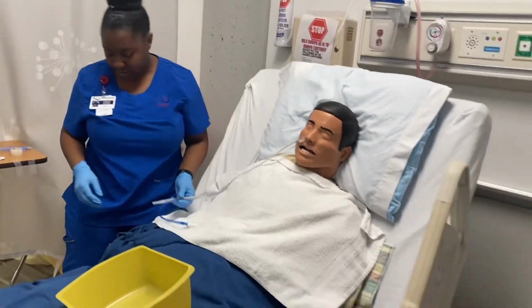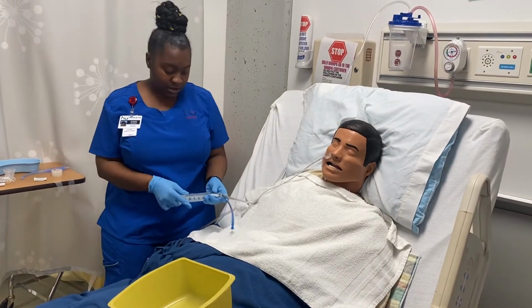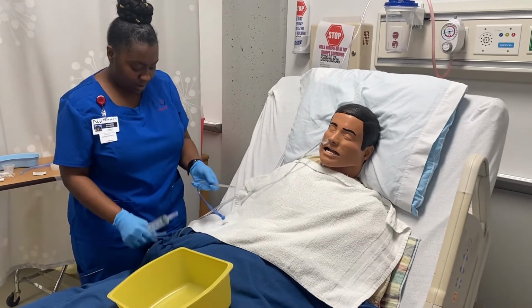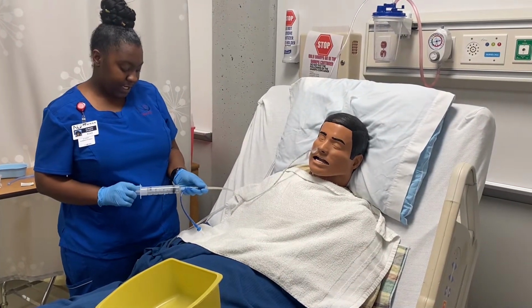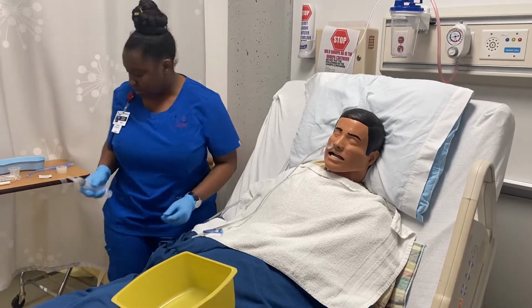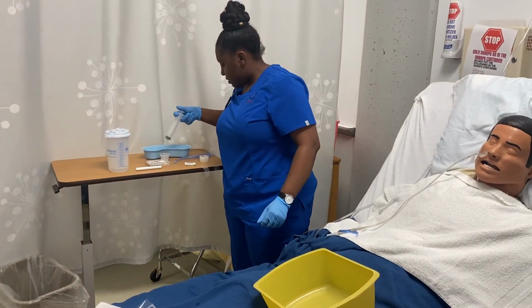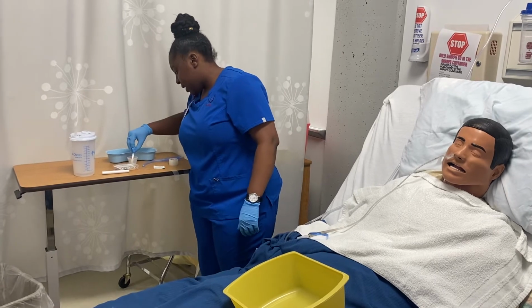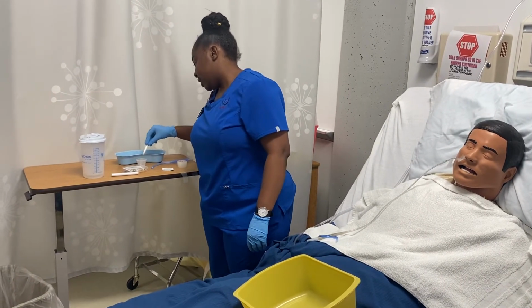And I'm going to take a piece of tape just to hold it there for the moment. Then I'm going to take my syringe, put it here, get some of the acid. Put it in the cup. pH should be lower than 4 to make sure that it's acidic.